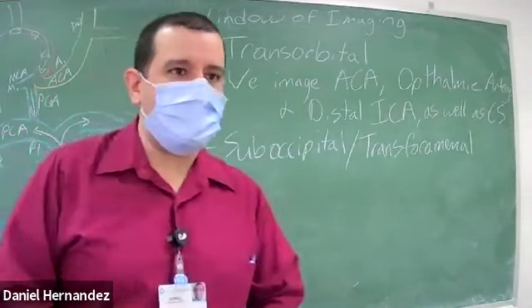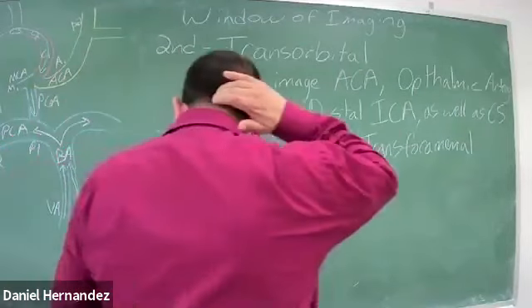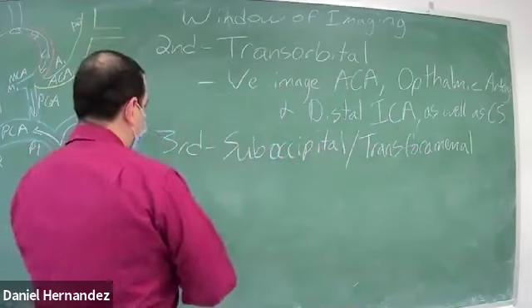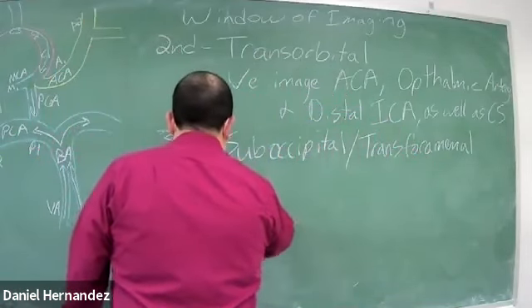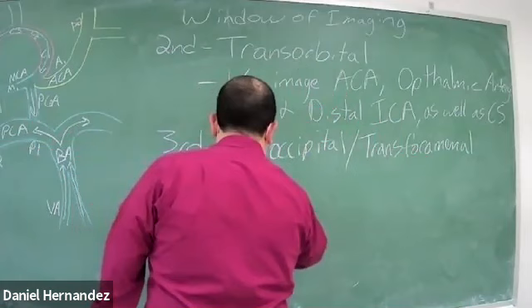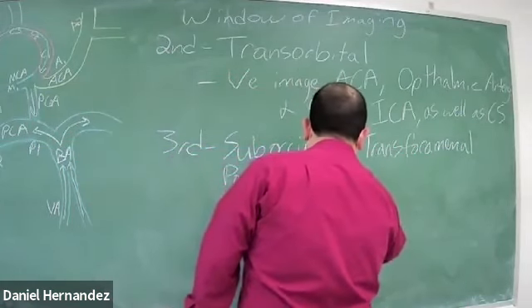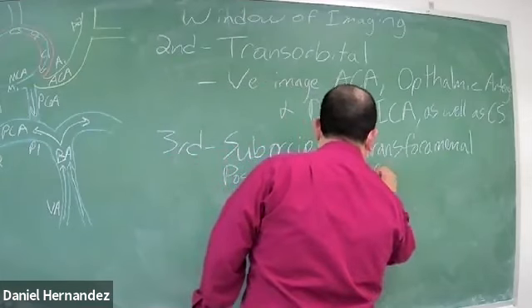This is the window that's going to be at the base of the skull, the posterior base of the skull.